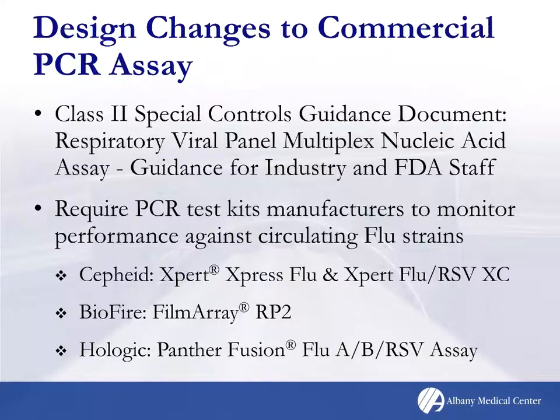The Cepheid Xpert Xpress Flu and Xpert Flu/RSV XC assays have expanded their target region, as have the BioFire FilmArray Respiratory Panel 2 and the Hologic Panther Fusion Flu A/B/RSV assay.